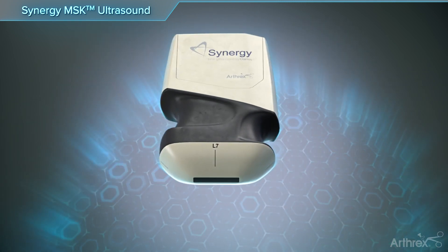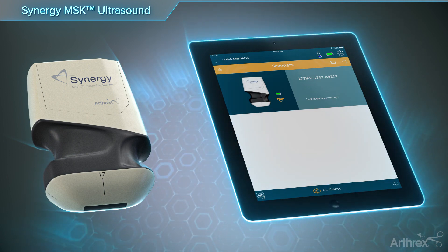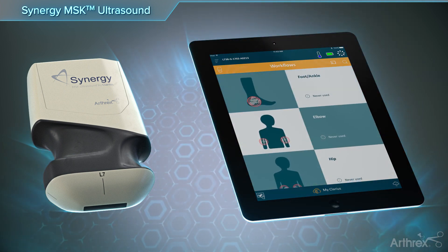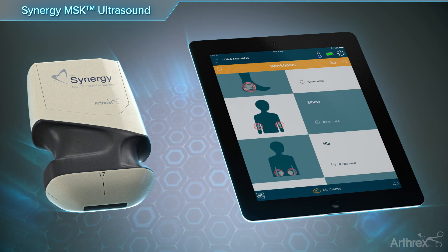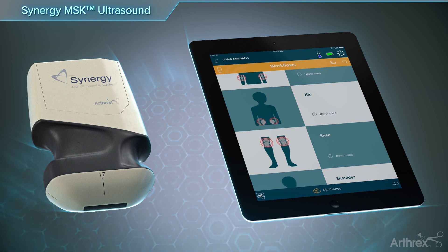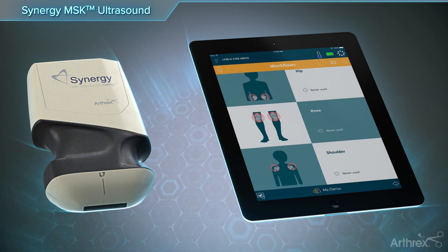Synergy MSK scanners use today's technology to communicate wirelessly to both iOS and Android smart devices. The Synergy MSK L7 scanner offers excellent needle visualization for both needle-guided injections and aspirations, as well as the ability to perform quick diagnostic exams visualizing soft tissue and bony structures.